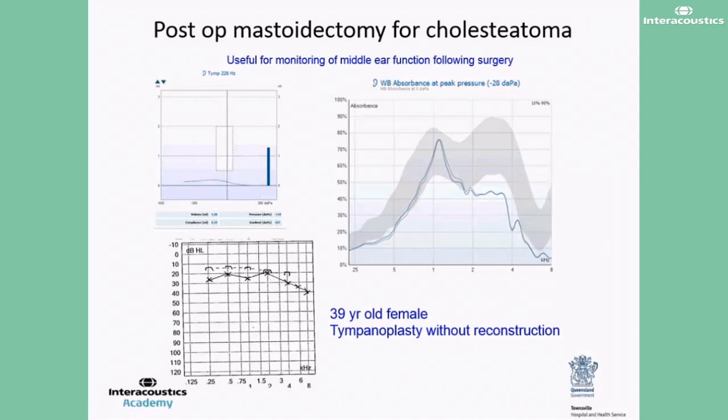Now, this wideband pattern can usually be used to monitor any recurrence of cholesteatoma. One way to monitor the cholesteatoma is to have either the X-ray or the CT regularly. So instead of exposing them to radiation, this could be a potential tool to monitor the progression of cholesteatoma.